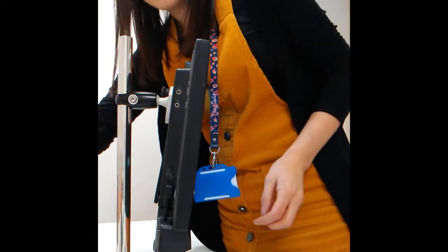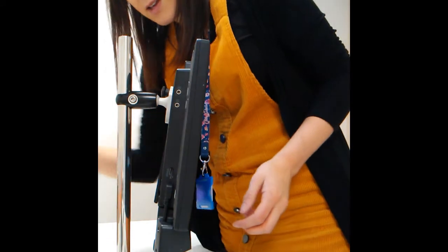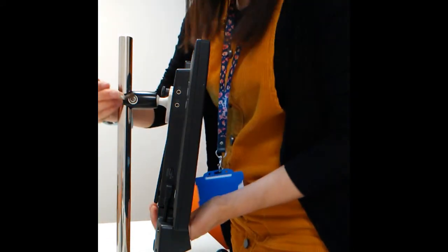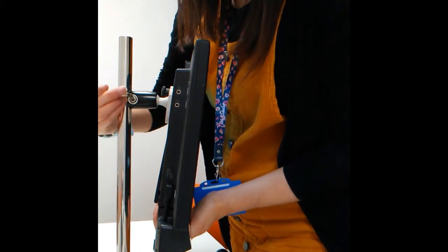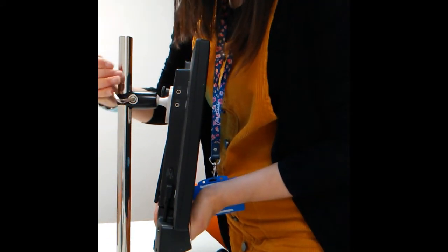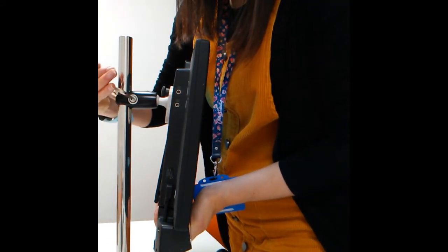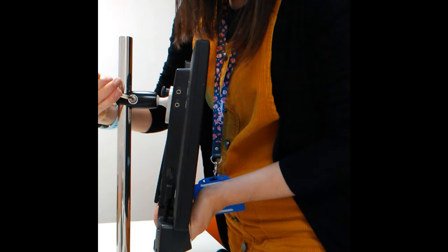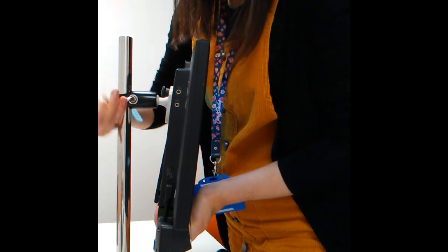I'm going to use my allen key just to adjust the screen. Make sure you keep holding the screen as you're doing this.